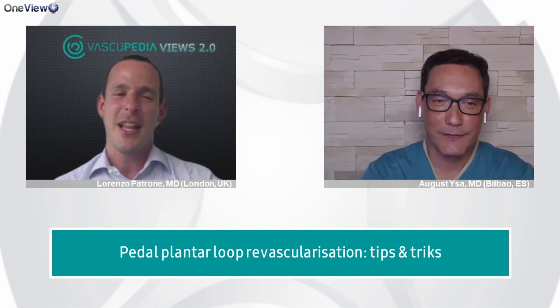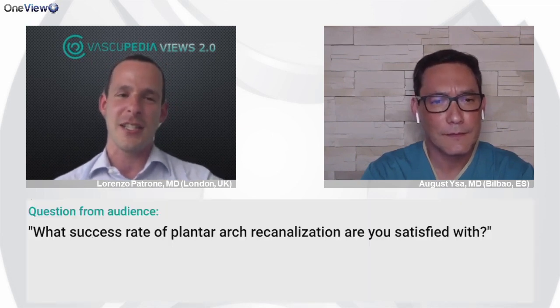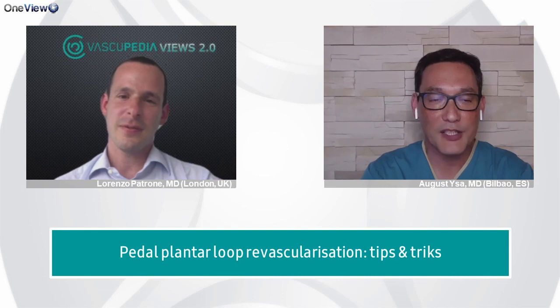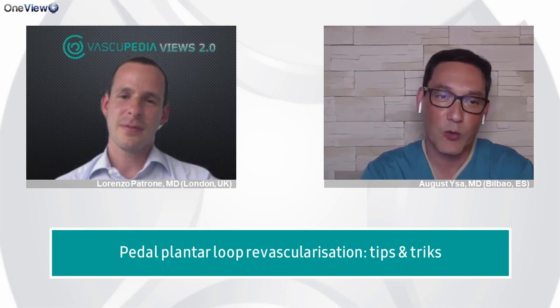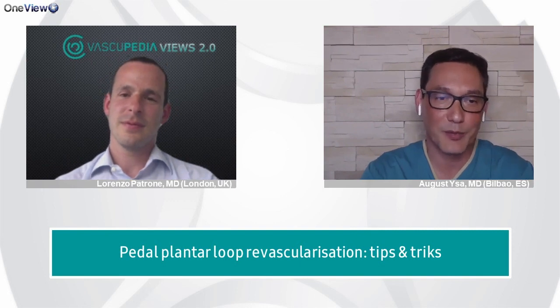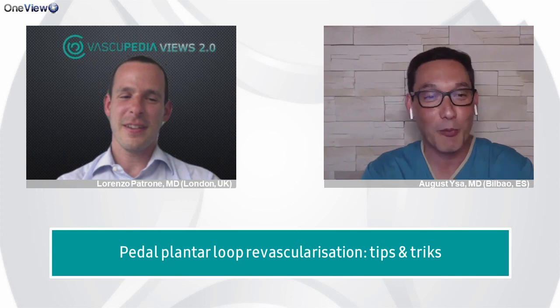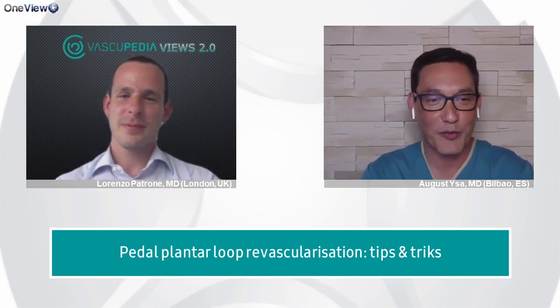And another question is, do you usually perform your procedures under local anesthesia or general anesthesia, for this kind of extreme puncture? No, general anesthesia, because since we perform our puncture on the road mapping, we need to have the patient quite still, otherwise it's quite impossible to perform that sort of puncture. You can even use nerve blockage, which is quite popular now, but I don't perform them.